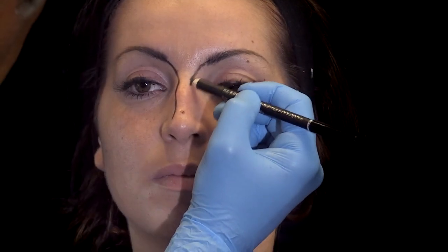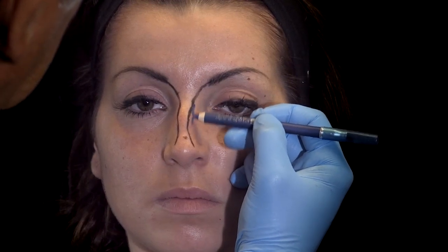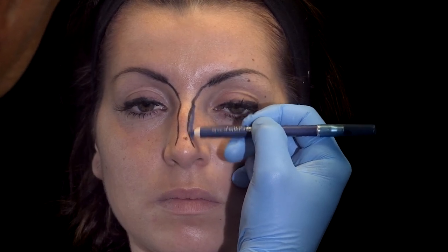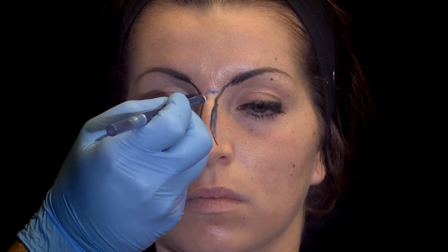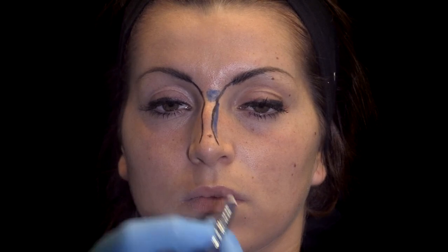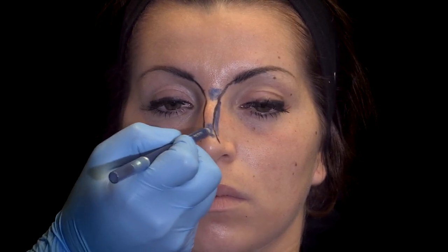In this video 3, we will see how to correct a nose deviation by drawing the aesthetic lines. We plan to inject laterally 0.2 or 0.3 ml of the cohesive gel. Then we will correct and hide the hump on the dorsum by injecting 0.2 cc on the naso-frontal angle, and then correct the supratip depression with 0.1 or 0.2 cc.